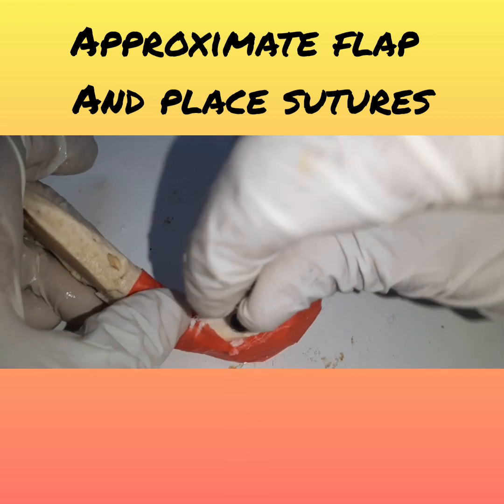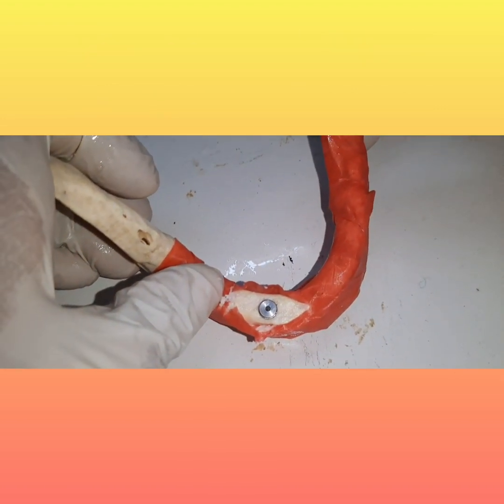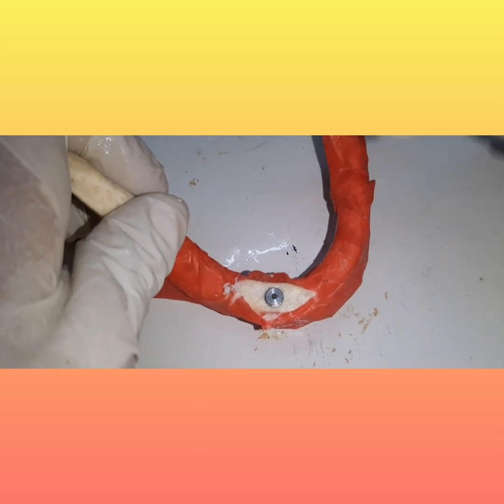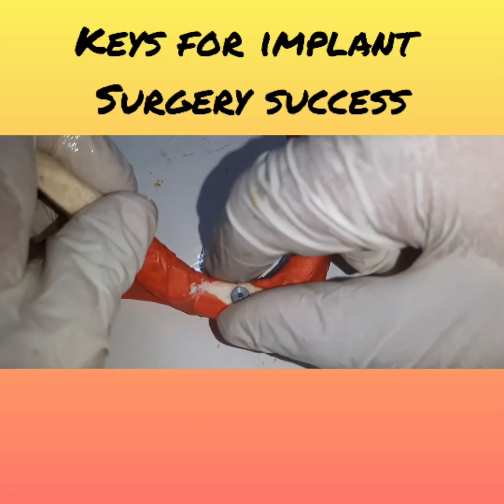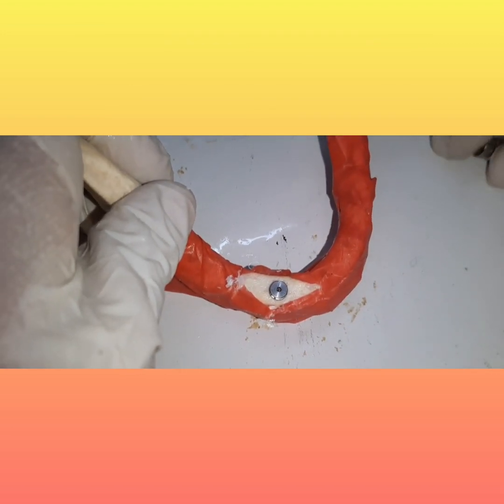So place the cover screw over the implant like this, and once we have done this, it is at the crestal level, you can see. And next step is to suture the flap like this, approximate the flap from both the sides, and then suture it.